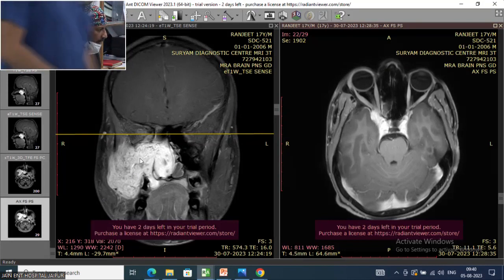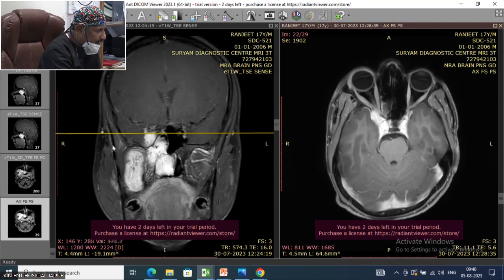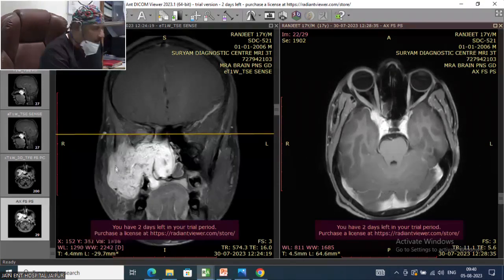And see where the tumor has gone far deep, even beyond. See, that is the mandible behind. Even anterior to the face of the mandible, going far laterally and far inferiorly down. See the huge, like a cricket ball again, prolapsing into the infratemporal fossa.